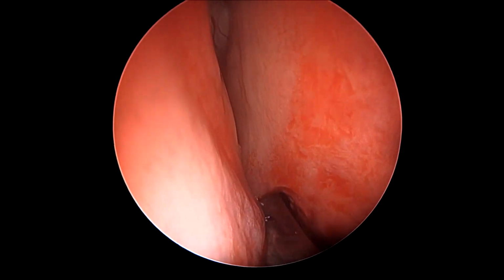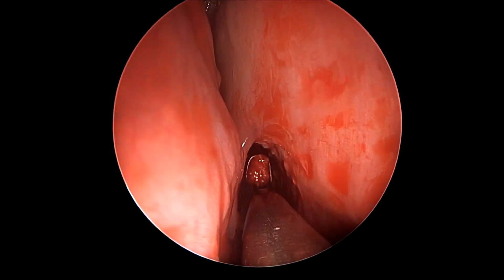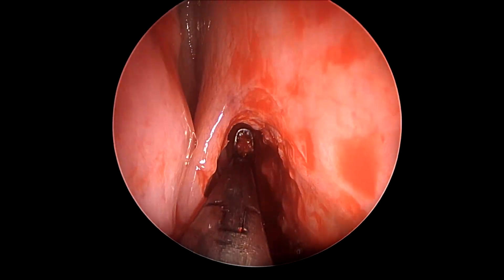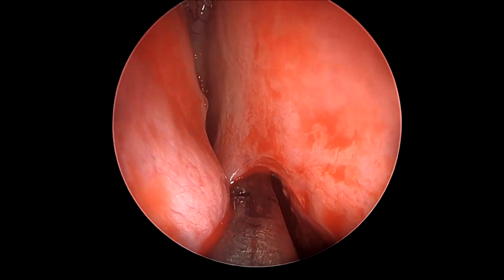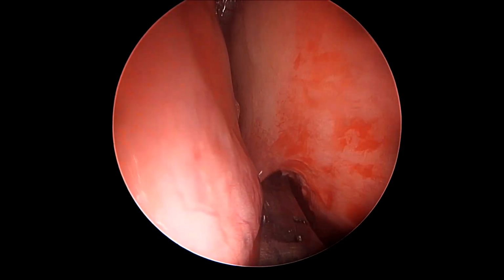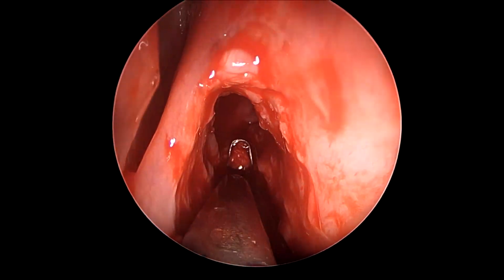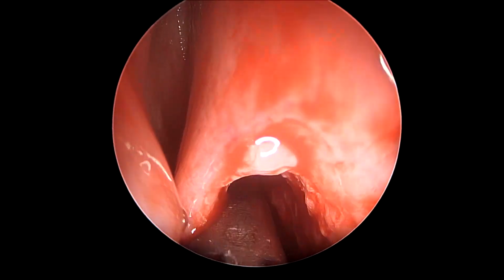Still, some bone from the frontal beak can be removed, and while this may not be compulsory, the straighter the trajectory towards the frontal sinus, the better are the outcomes from nasal irrigation in the post-operative period, thus ensuring lesser recurrence rates in these patients of polyps, which essentially involve the anterior ethmoids and the frontal sinus.